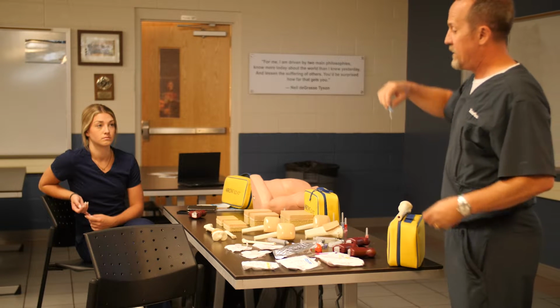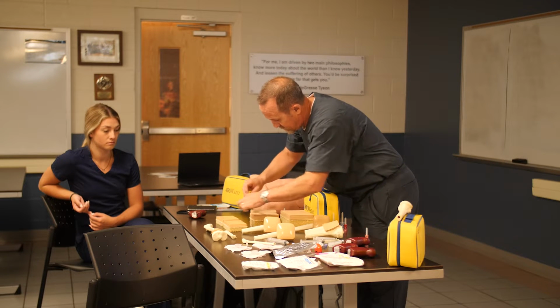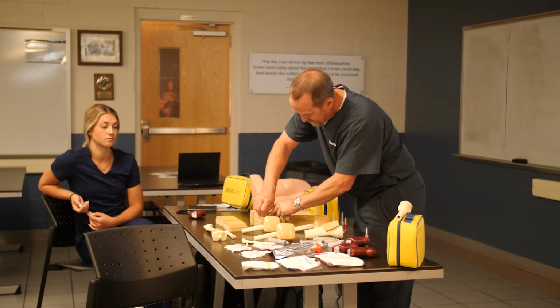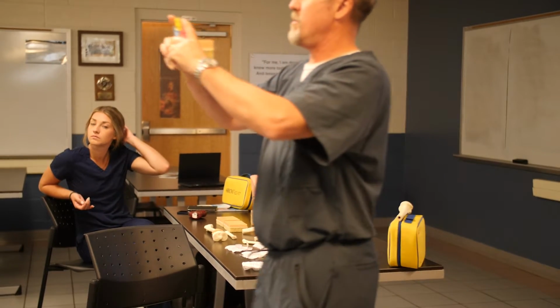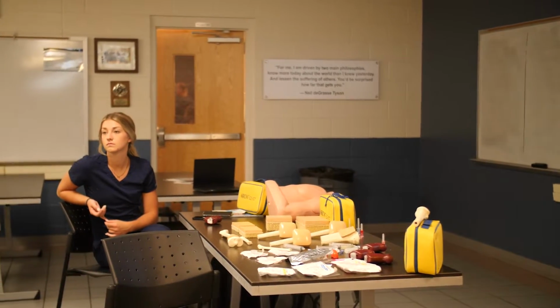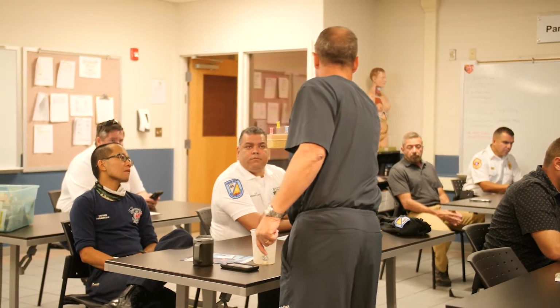so we can get through that cortical bone, okay? I'm going to stick my needle sets into a bone block here and walk around and let you take a look at what I mean. When I push down to hard bone, you can see with the pink one, I don't see a black line. So that's not going to be long enough to get through that soft tissue. But on the blue one, you still see at least one black line above the soft tissue. That means that needle and catheter still have enough length to get through the cortical bone and actually get to the medullary space. Does everybody see that?